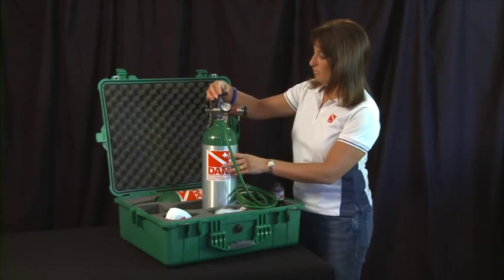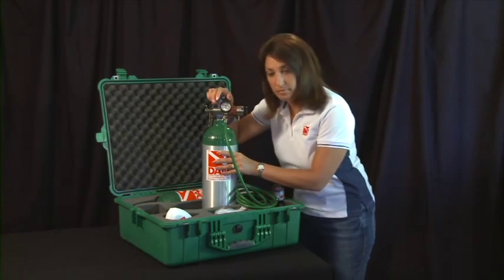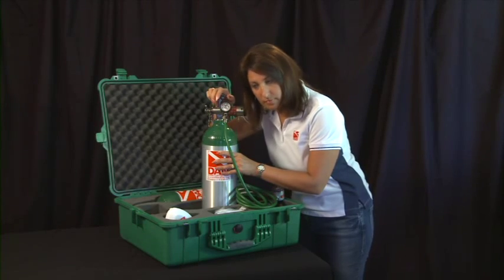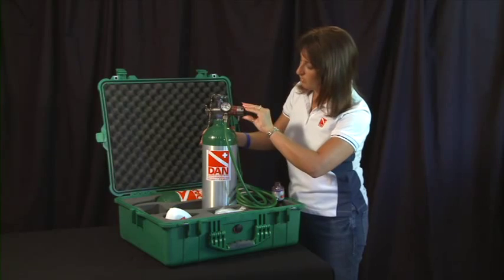Check to make sure the system is functioning by pressurizing it and listen for leaks. If there are no leaks, turn off the cylinder, depressurize the system, and store the unit.